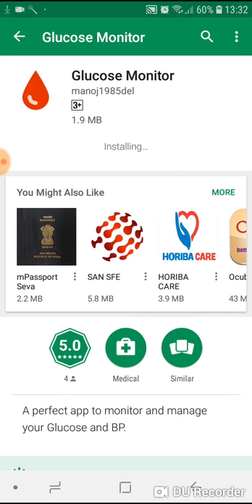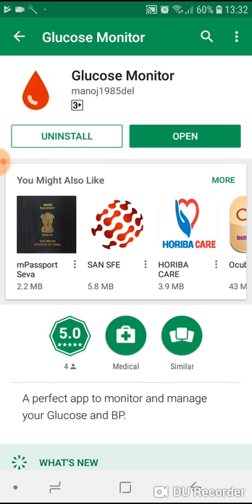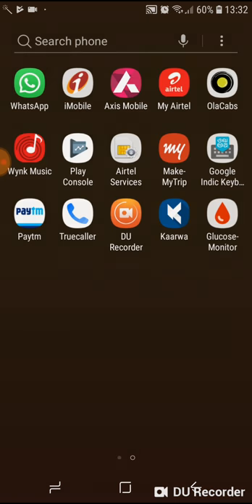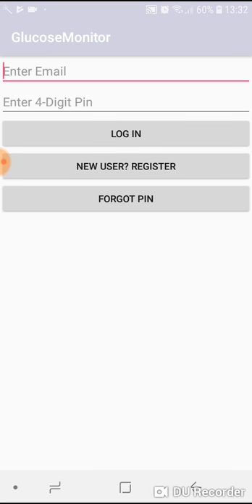In a flash of seconds the application has been installed. I'll go to the application and see the basics how it works. If you see on my screen, there's a blood icon called Glucose Monitor. I'll tap it. If you are a new user, you have to register yourself.